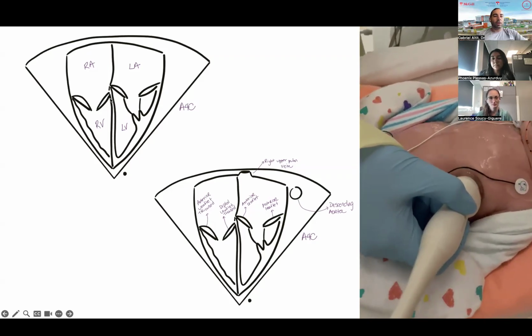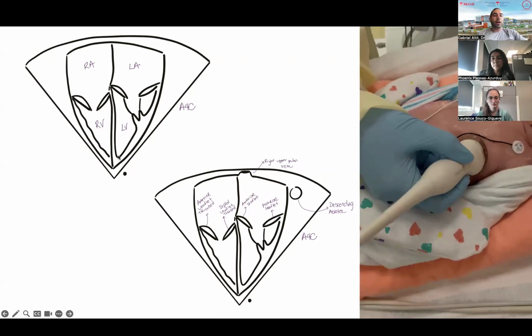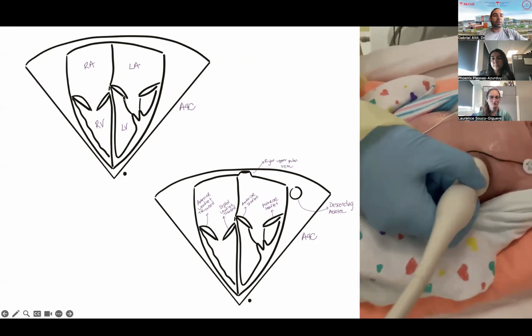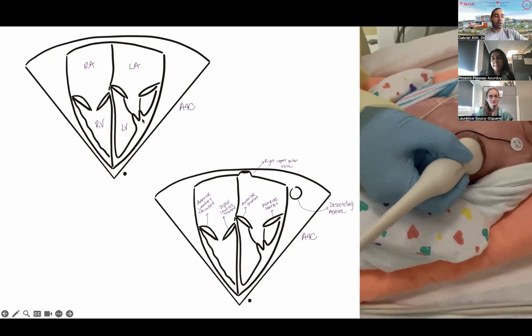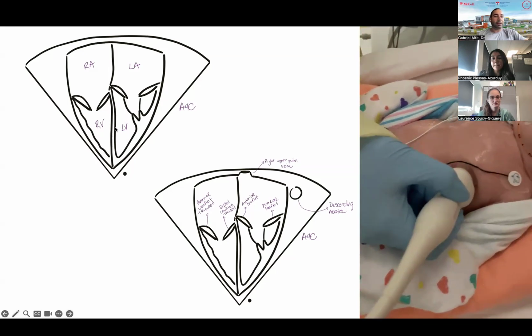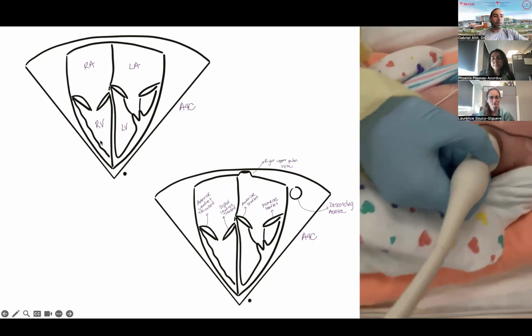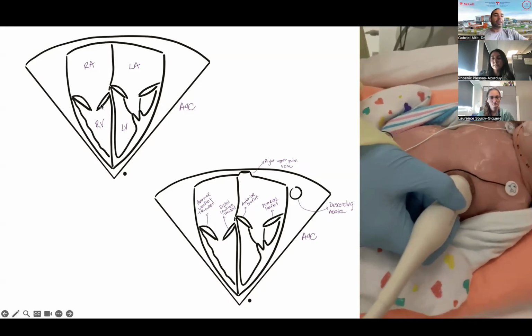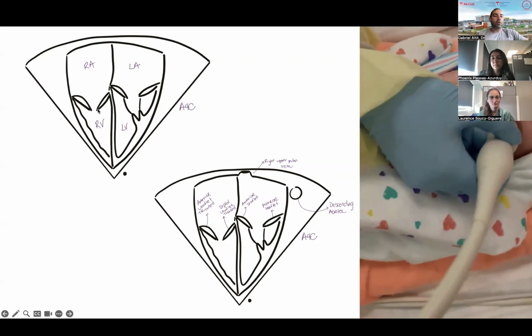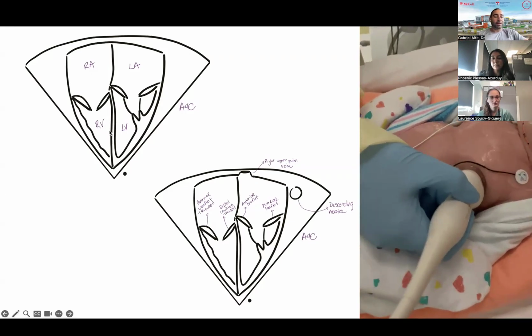Typically, the septal zone is also more trabeculated versus the LV, where the septal zone is very smooth. The left ventricle will typically have two papillary muscles with attachment to the two leaflets of the mitral valve that are coming off the free wall of the left ventricle. You never have septal attachment. The RV will typically also have a moderator band, which is a band of muscle that goes from the lateral wall to the septum, and the septal leaflets of the tricuspid valve, which has three leaflets, will typically attach to the septal side of the right ventricle.